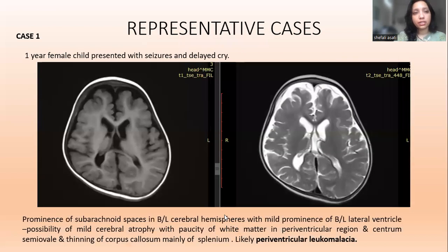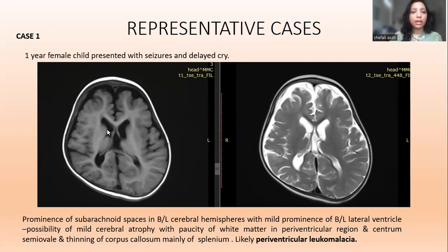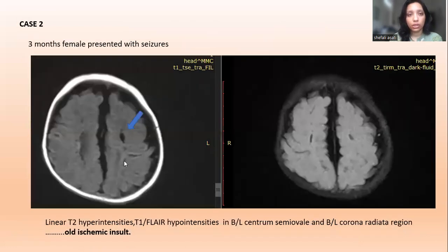Case 1: A one-year-old female child presenting with seizures and delayed cry. On T1-weighted and T2-weighted axial MRI, there is prominence of the subarachnoid spaces in the bilateral cerebral hemispheres with mild prominence of the bilateral lateral ventricles, suggesting mild cerebral atrophy, with paucity of white matter in the periventricular region and centrum semiovale, and thinning of the corpus callosum mainly at the splenium — likely periventricular leukomalacia.